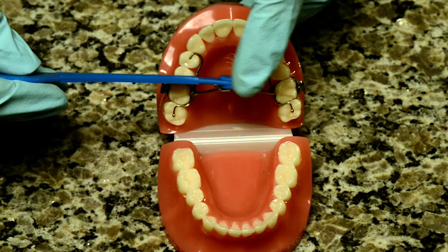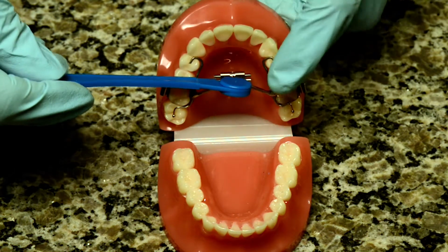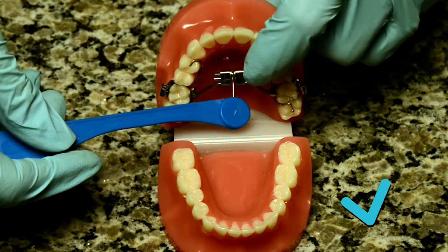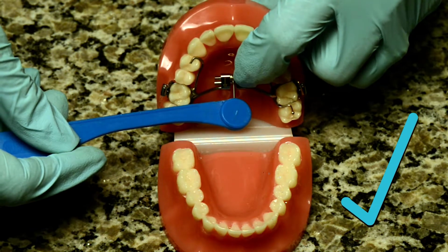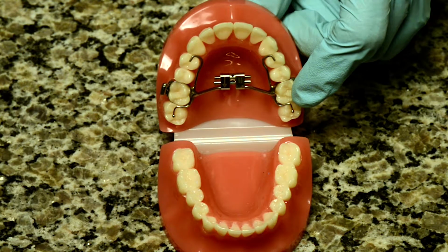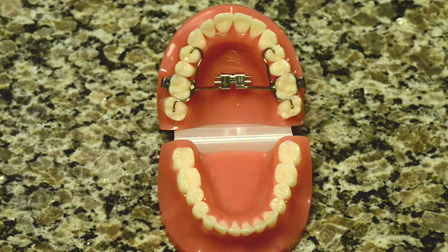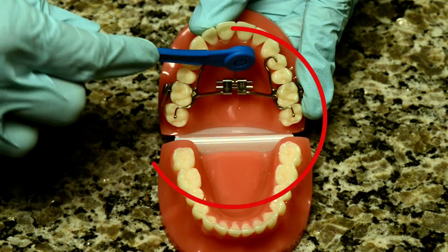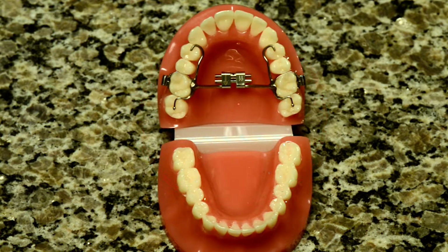Once you have pushed the key to the back of the throat, check that you can see the next hole. If you cannot see the next hole, you have not pushed back far enough. If you can see the next hole, wiggle the key gently out of the mouth. You will then have completed 1 turn. When you are removing the key from the mouth, be sure not to pull back towards the front of the mouth. That will reverse the turn that you just completed.